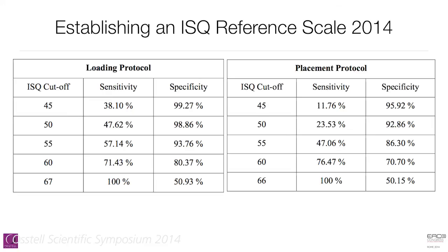If your patient is pushing you to have immediate provisionalization, and it's understandable in the front, who wants to walk around with a flipper or a bonded bridge?